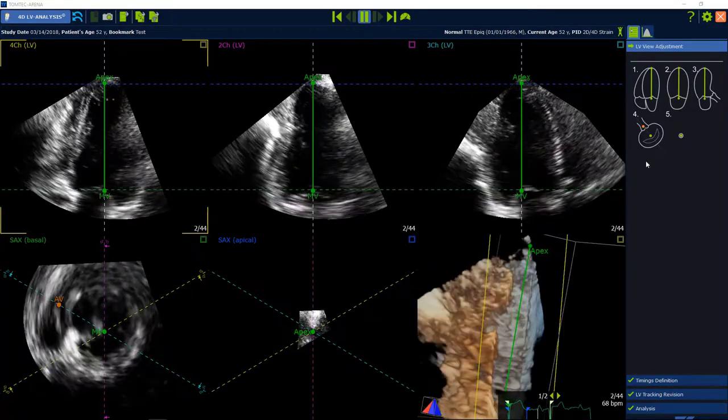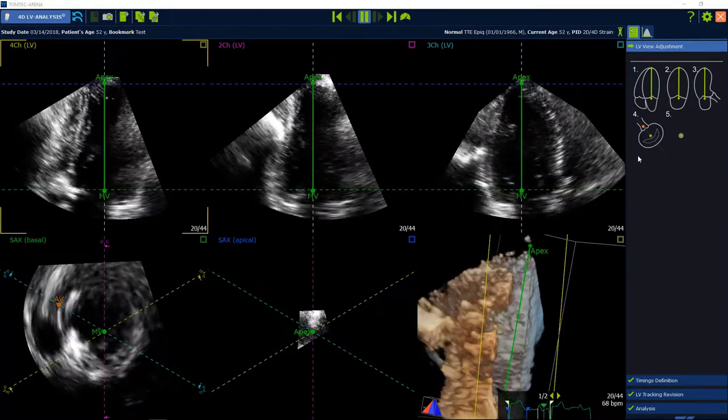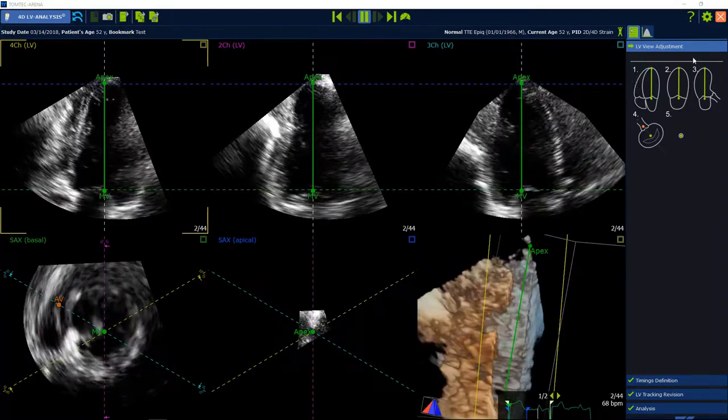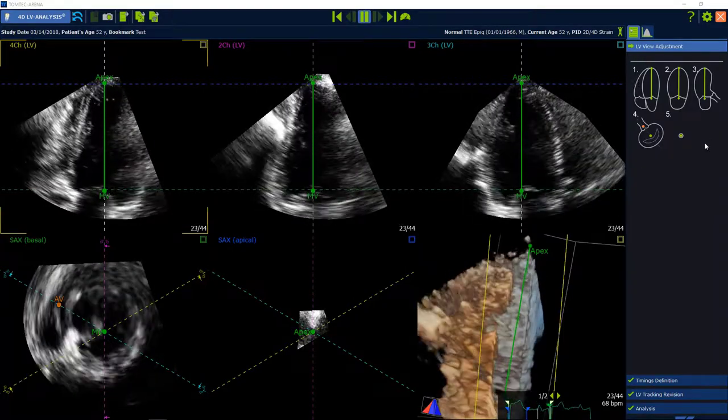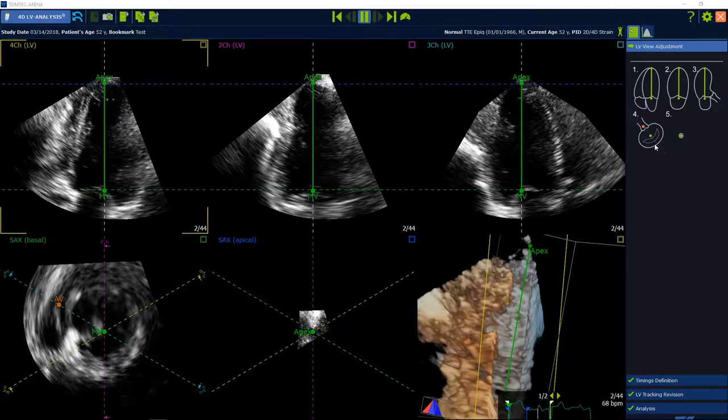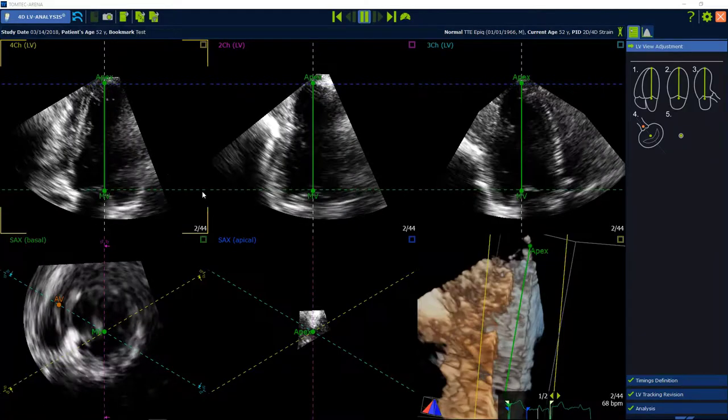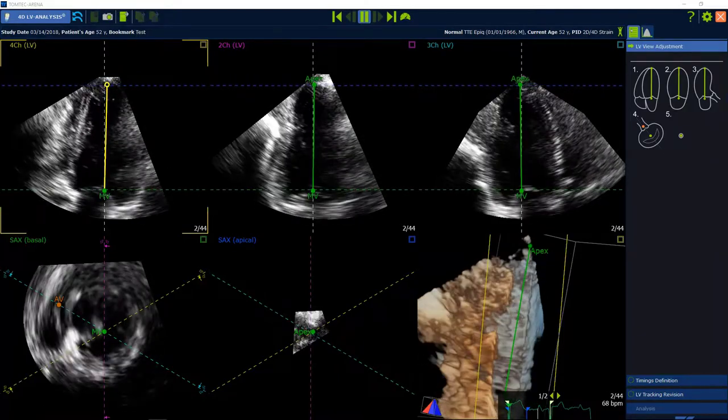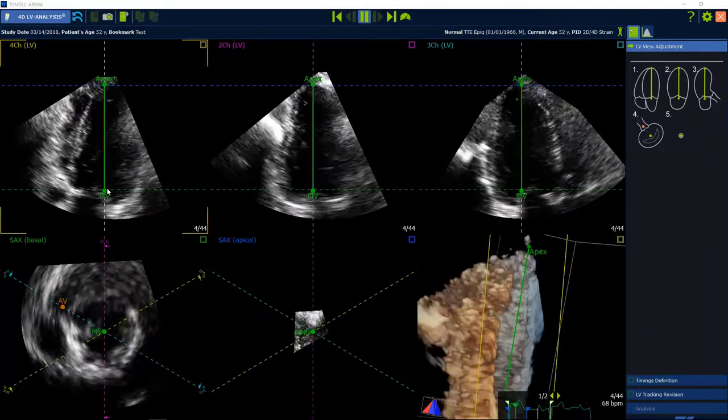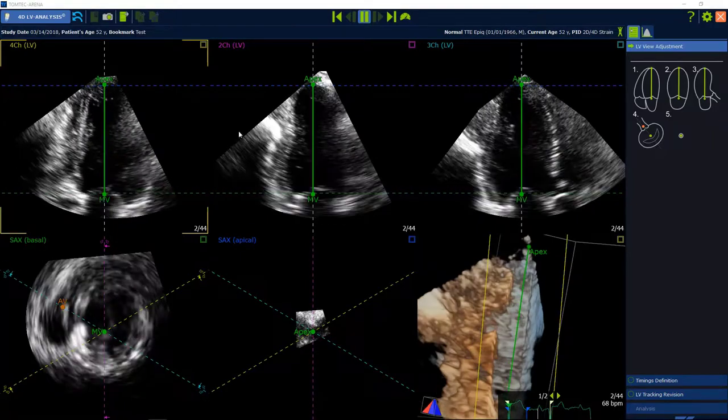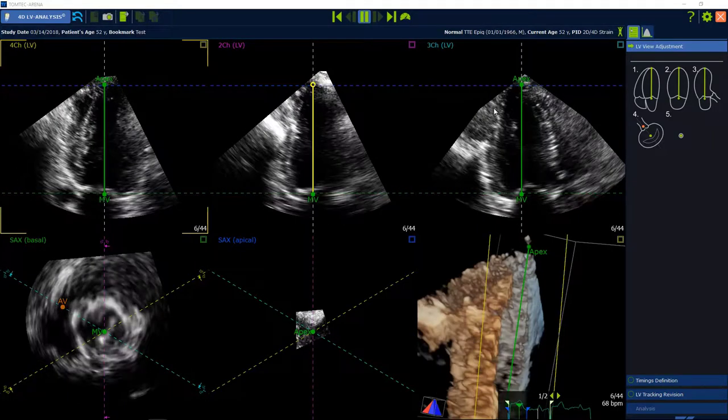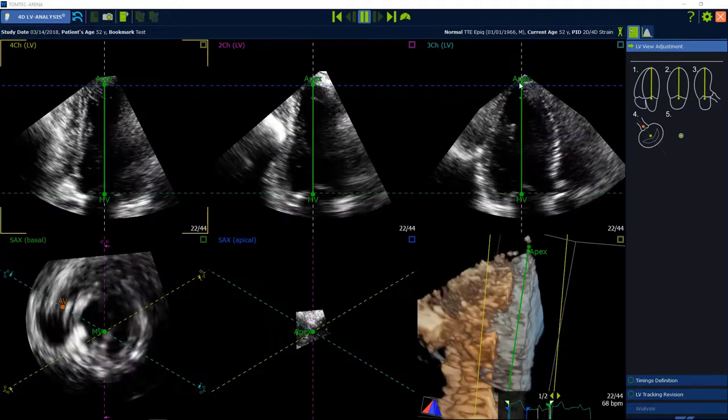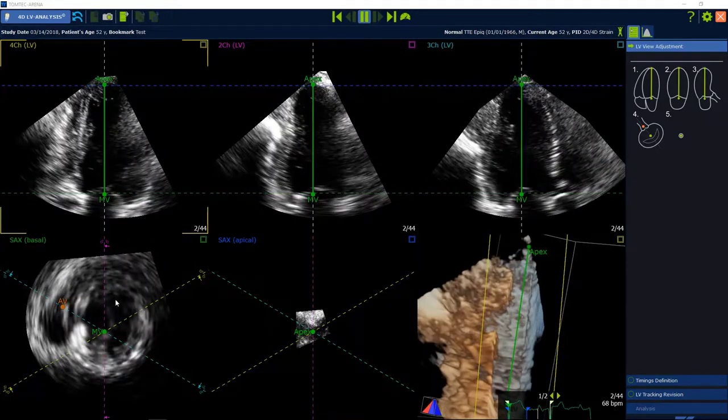When you have deactivated you need to check and adjust the views. Please use the helping guide on the right. In step 1 to 3 drag and drop the basal and apical points for an orthogonal orientation.